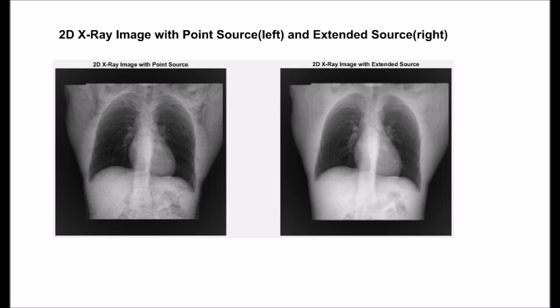With the ideal point source, as expected, the X-ray image is shown in this figure. We see the spine, ribs, heart, and organs below the lungs. Since the heart is occupying more space in the Z direction, in other words, it is occupying more of the slices, the color of the heart is closer to bone, as well as the other organs.